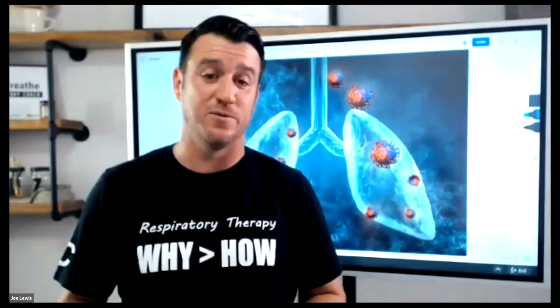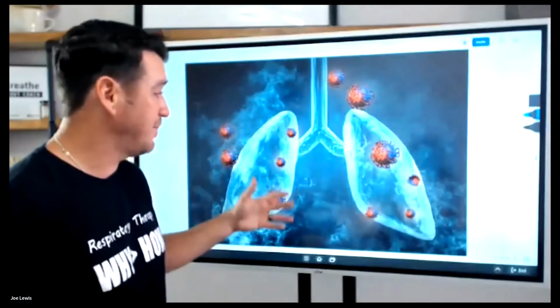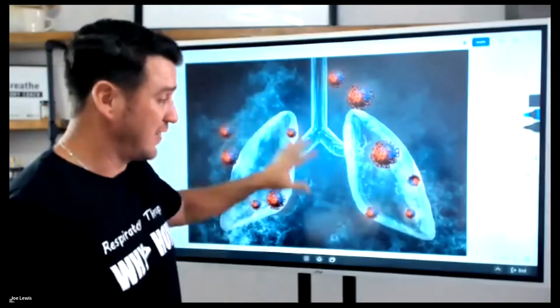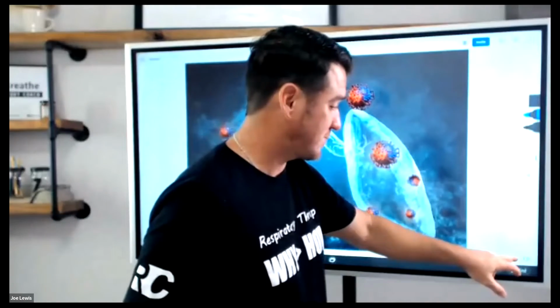And if you're doing that, put it in the chat for me so you can tell me about it, because I have talked to one individual who said, yes, we were using this during COVID and they actually had pretty good results with it. So it's interesting. We've got to get our people back to breathing negative pressure ventilation like we were meant to, right? And when we have to go on positive pressure, recognize that this inflammatory process is at play and we need to take all efforts to reduce it.